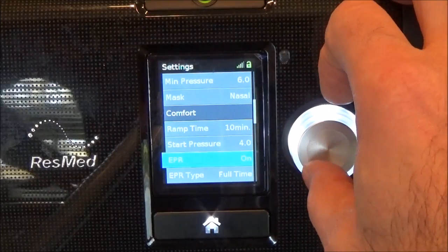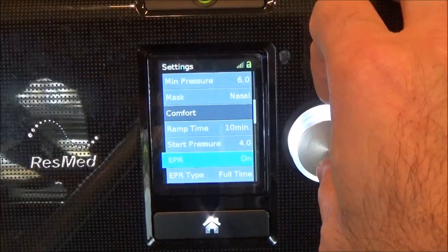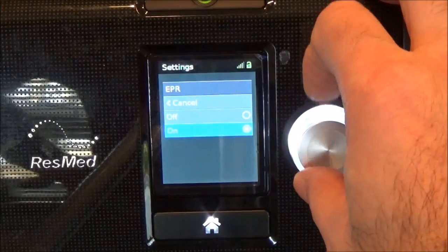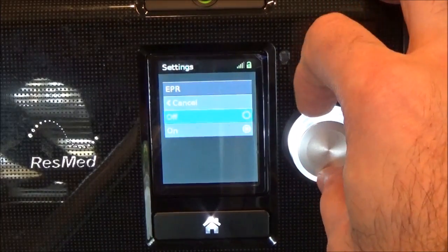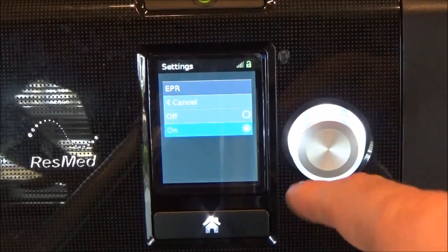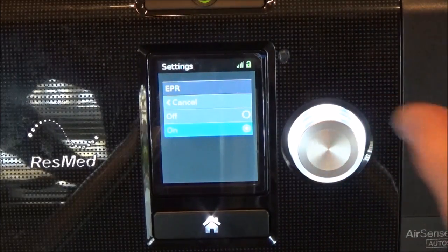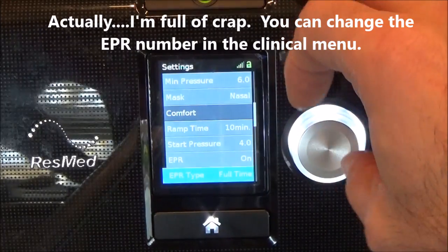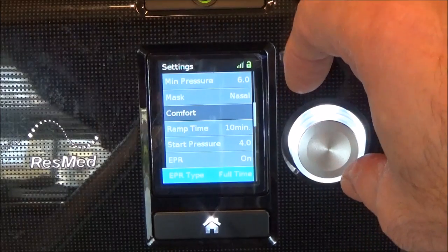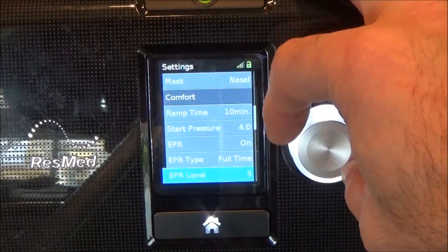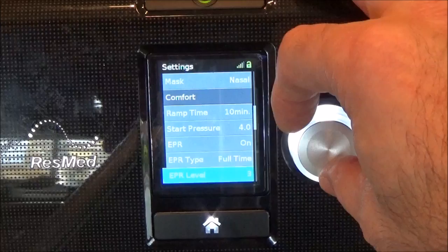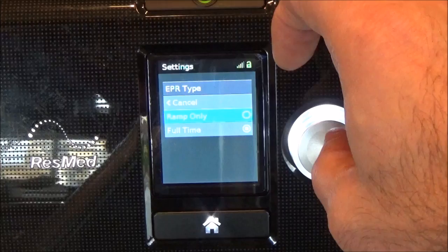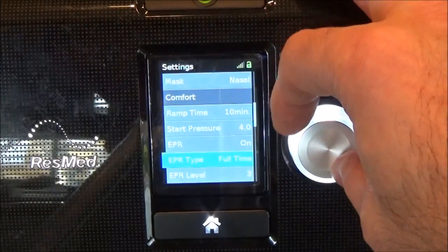EPR is expiratory pressure relief — this is when you exhale and it will dip the pressure. This is actually one centimeter of water pressure. You either enable this or disable it. But when it's enabled, you have to exit the clinical menu and go into the comfort settings on the user settings to actually set the number. Word to the wise: just use this for about the first month or so and then turn it off, as it seems like it can cause central apneas — when we turn it off, those tend to go away. EPR type can be active only during the ramp segment, which is cool if you use the ramp, or you can have it on full time throughout.